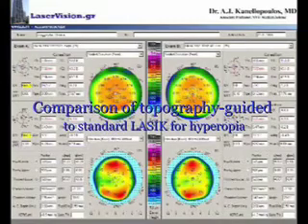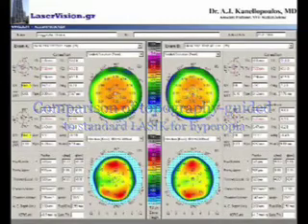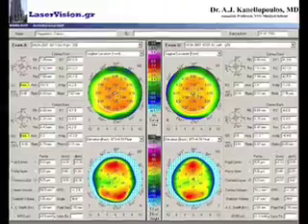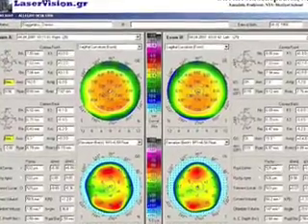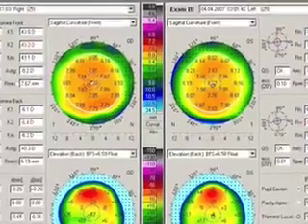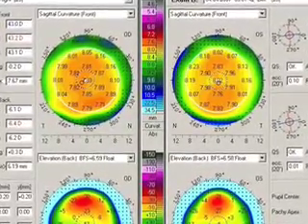Hello, my name is John Kanellopoulos and I would like to show you an example of a patient with hyperopia, seeing here the preoperative Pentacam maps of the right and left eye, treated in one eye with topography-guided hyperopic correction with the WaveLight IQ laser and the IntraLase, in order to adjust for angle kappa.